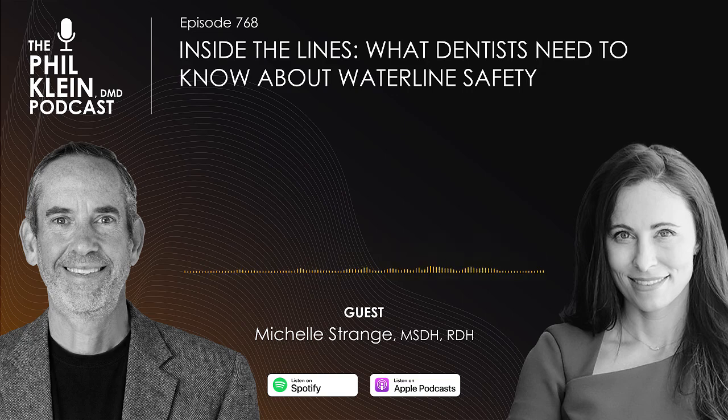Yeah, and that's exactly what I call it, your trifecta. These are the three things that are going to work together to make sure that what you're doing day in and day out is actually working. So we test. You will never know what's happening in your water lines unless you're testing. We are not working off of hopes and prayers as healthcare providers. We need testing. We spore test for our autoclave, right? We have chemical indicators for our packaging. We have a lot of these quality assurance programs in place to make sure that we're working off of facts, and the test is going to bring your facts.